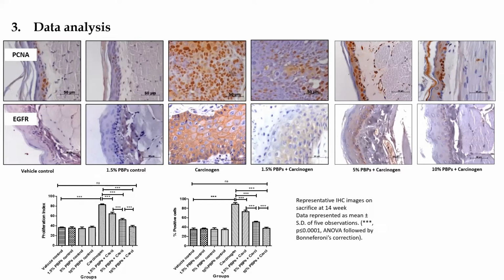This cutoff is going to be different for different types of histologies, right? Different types of tissues. Correct. So right now I have shown you only the percentage positive cells data.